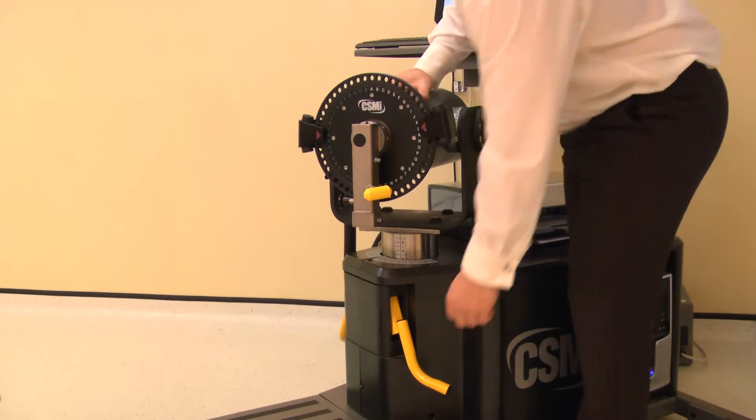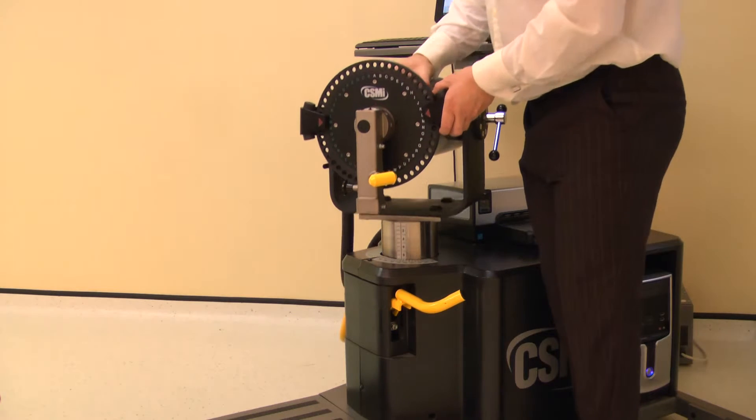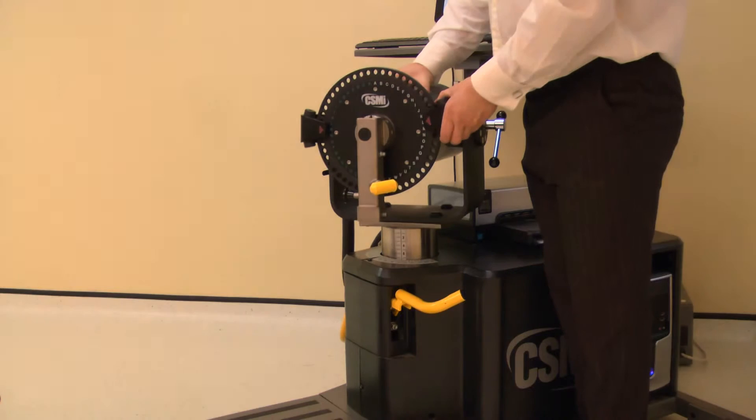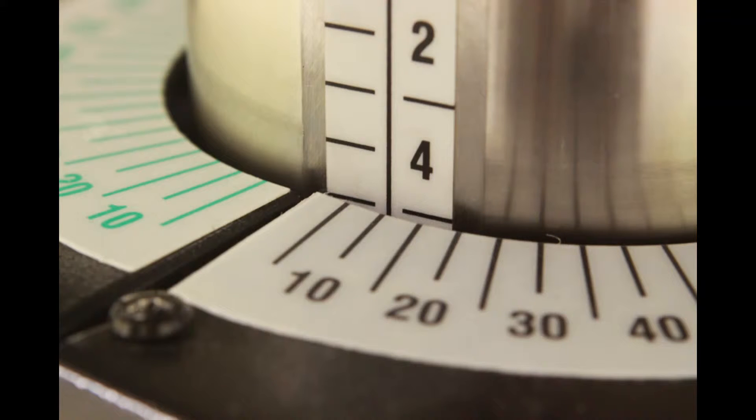The dynamometer height and rotation are adjusted together. Lift the locking handle to release. Rotate the dynamometer to 10 degrees on the black scale, then adjust the height to 5. Ensure both locking handles are pushed down to secure.